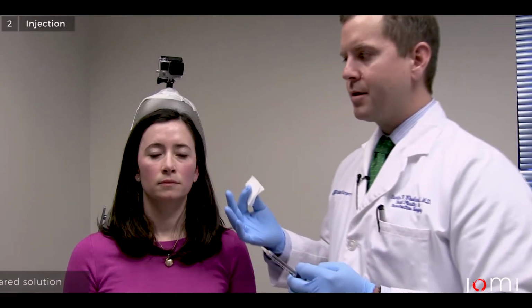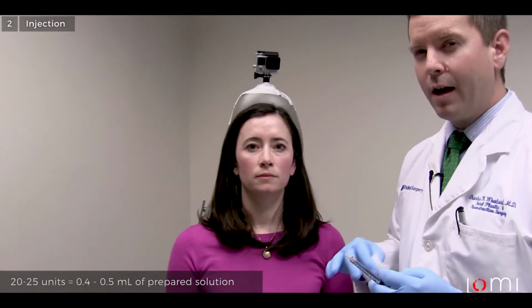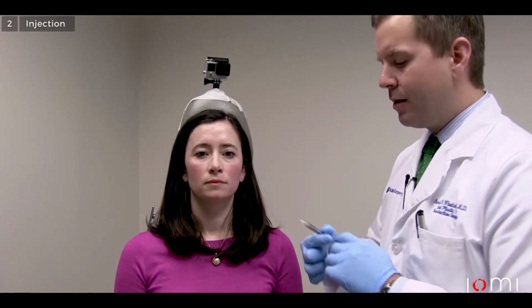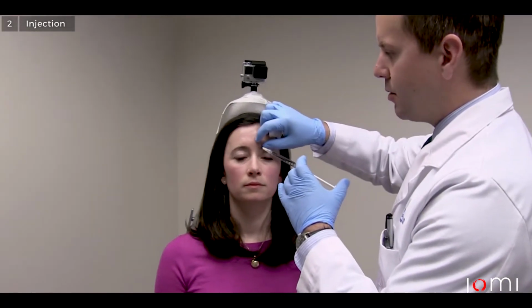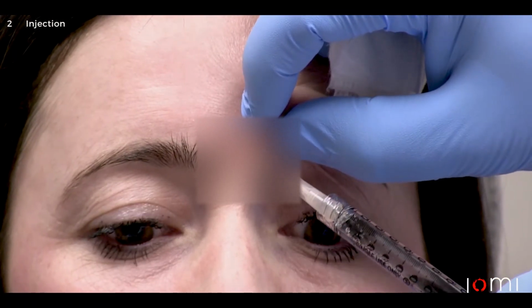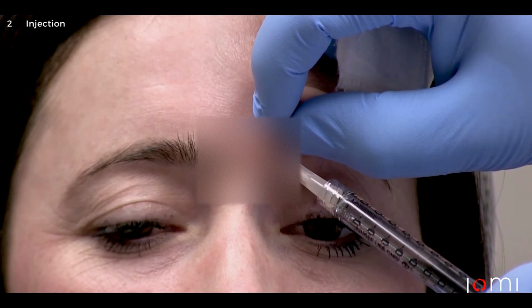So typical treatments in the glabella region, we're probably not going to need as high a concentration for her because we didn't have a whole lot of corrugator activity. It would be approximately 20 to 25 units. I tend to inject those in 5-unit aliquots in the central region of the face. What I'll tend to do is pinch the brow in this region and remind the patient that they need to breathe. And then a small stick here.